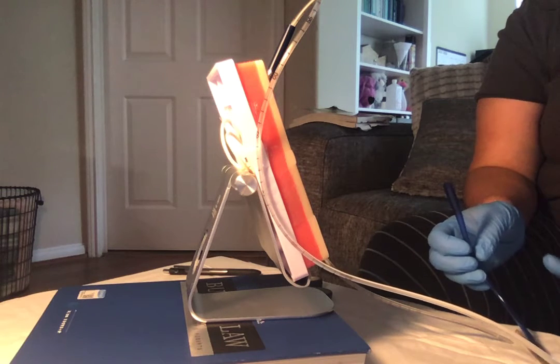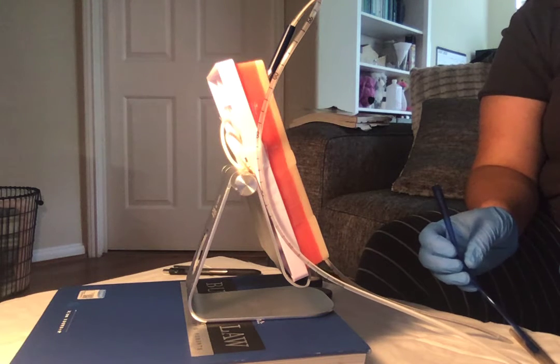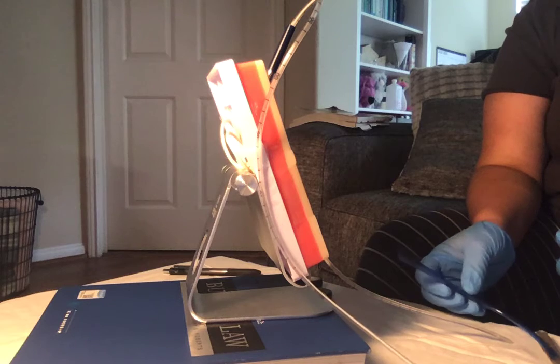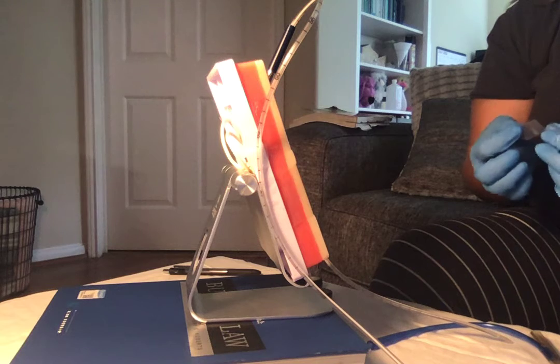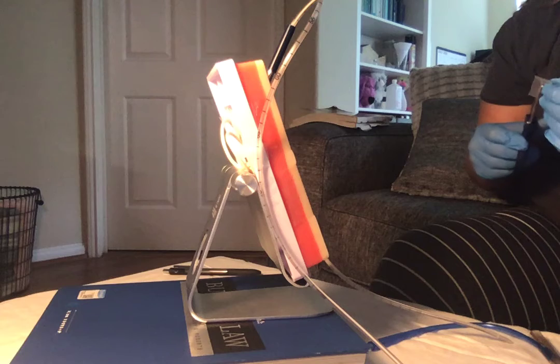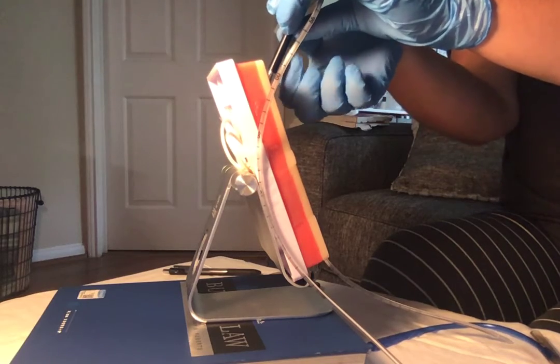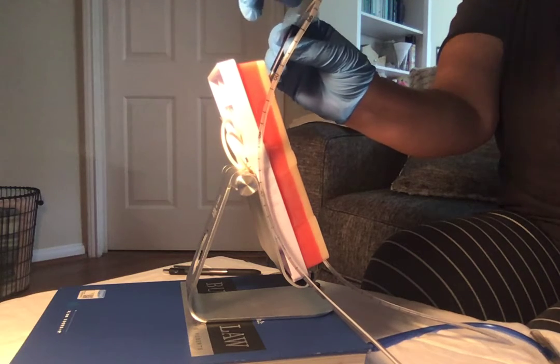If hospital policy, we will then test the pH of the aspirated contents and re-inject the aspirate or an air bolus and listen with the stethoscope over the gastric area for any swishing sound. Once confirmed, we will now anchor the tube to the nose. Doing that, I'm going to cut my tape into a Y formation, place it on the nose, and wrap my tape around the tubing to secure.